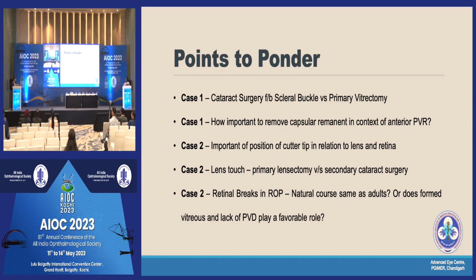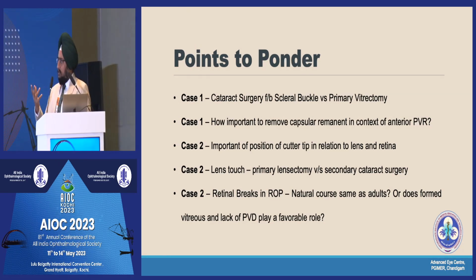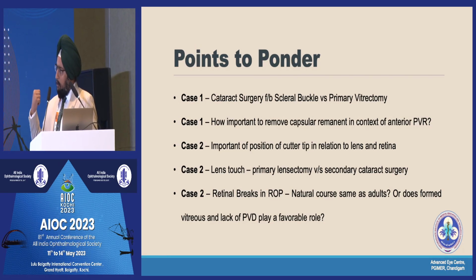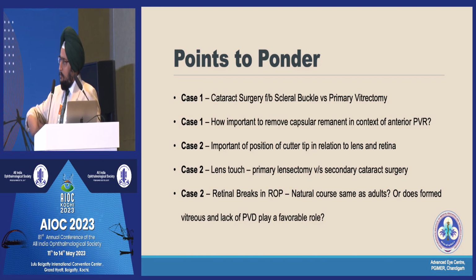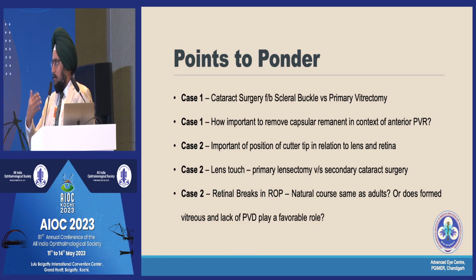Actually, the traditional teaching is that way, sir, but my experience has not been the same, especially in stage 4 cases. You don't need to be too aggressive once a break happens, going around, because you're never going to get the hyaloid out. Yes, it's good to leave that hyaloid back there. Maybe if your fluid-air exchange settles it, do some laser, but don't fiddle with it too much. If you reduce the vitreous too much, then the fluid is going to go in through it.